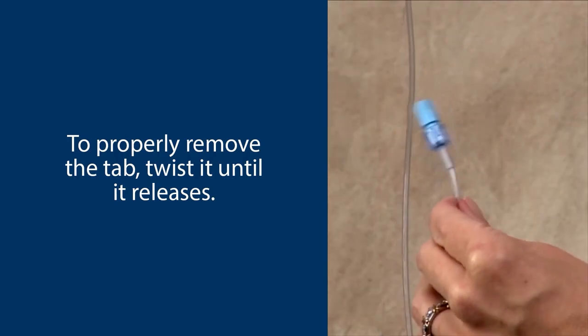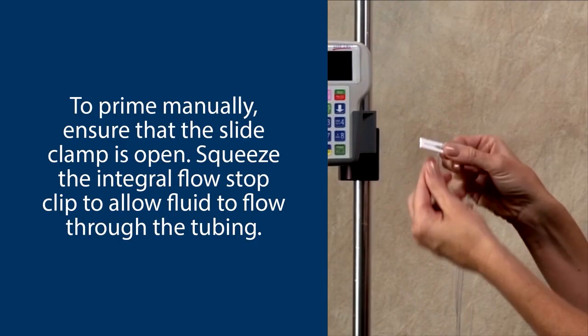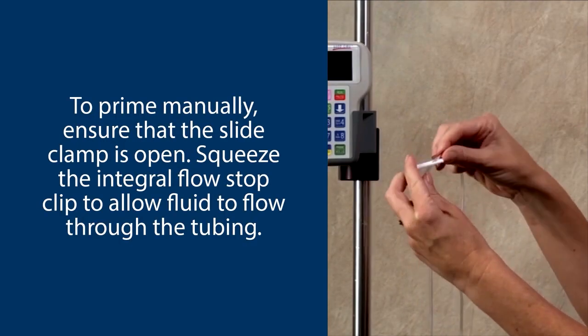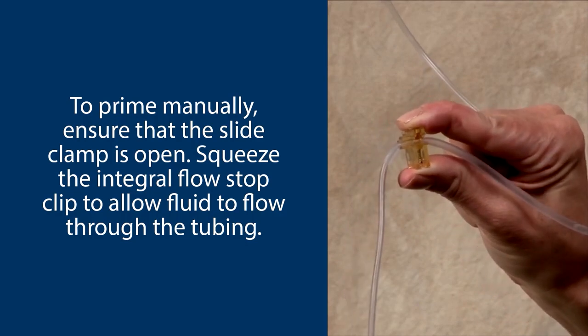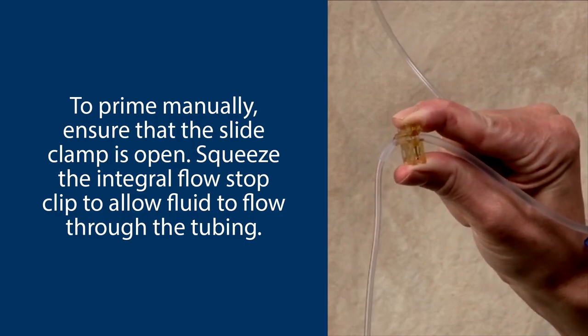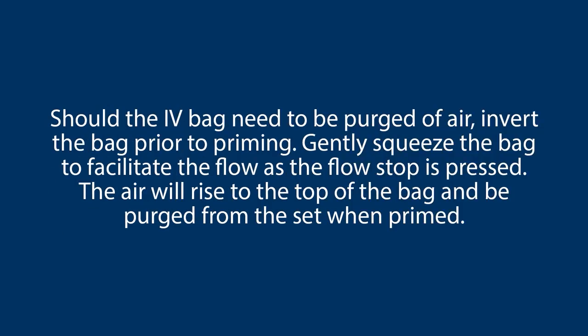When priming, the vented lower cap can remain in place to help prevent contamination. To prime manually, ensure that the slide clamp is open. Squeeze the integral flow stop clip to allow fluid to flow through the tubing. Release the flow stop when the set is fully primed. Should the IV bag need to be purged of air, invert the bag prior to priming. Gently squeeze the bag to facilitate the flow as the flow stop is pressed.